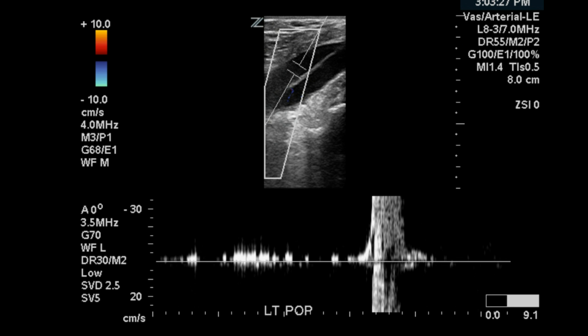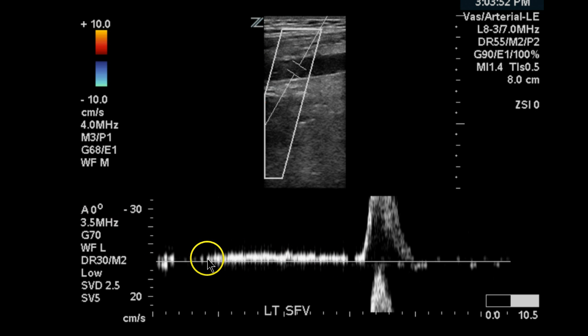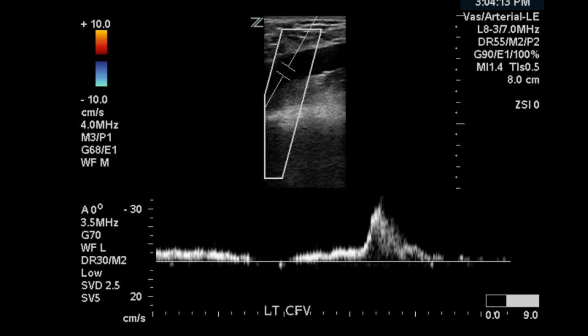Now we compare that flow with the contralateral leg. You can see here the popliteal and the femoral vein. This is more venous flow — though continuous, it's still venous flow. So it's not pulsatile like what we saw on the right in the common femoral vein.